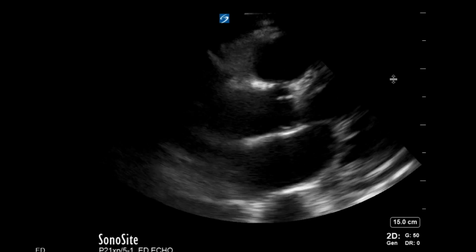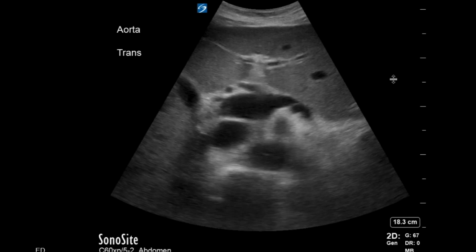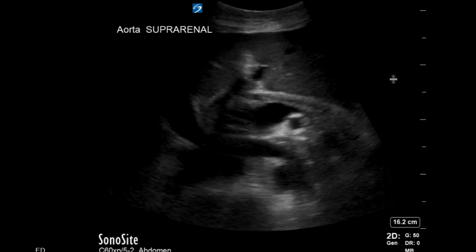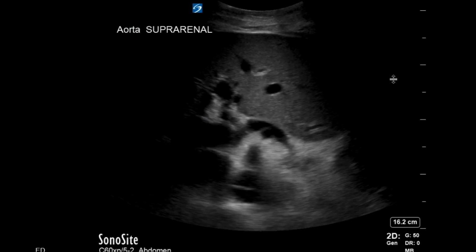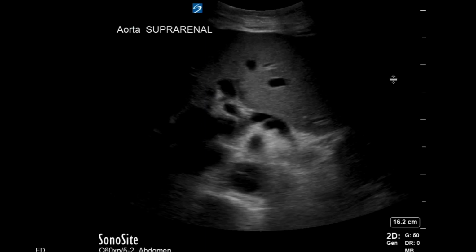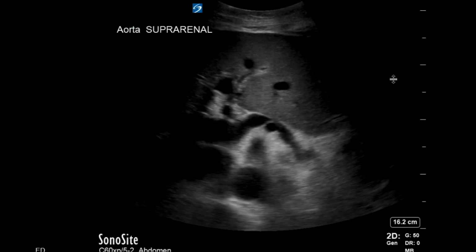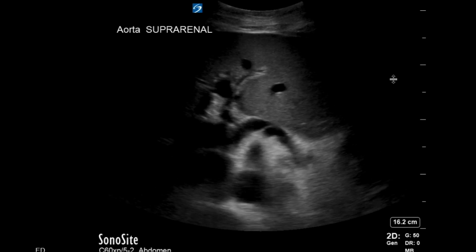Got it. Yeah. So other ways, in general, sometimes people can get confused between the IVC and the aorta when they're scanning. They did a good job of recognizing the IVC here. But generally, the IVC is going to be more thin-walled, can sometimes be compressible if you use enough pressure, and is towards the right of midline, versus the aorta, which is going to be more thick-walled, will be pulsatile, not going to be compressible, and it's the left of midline.